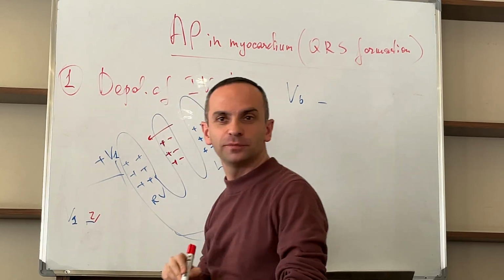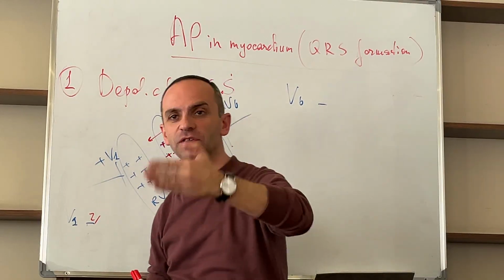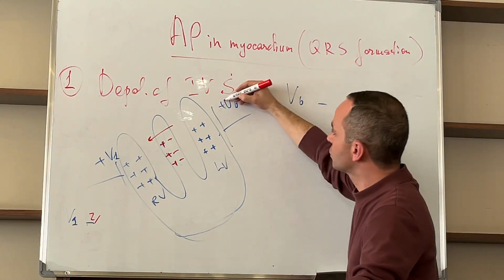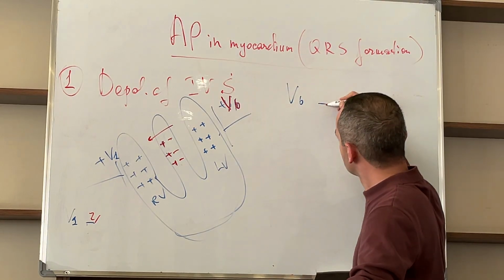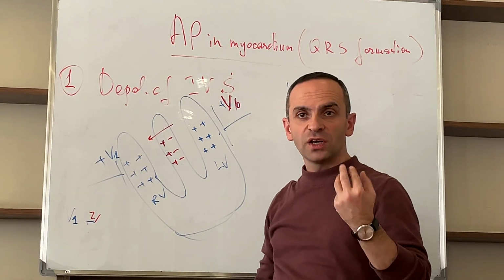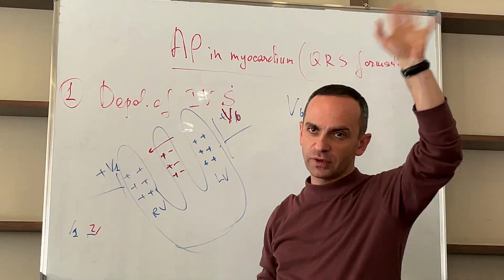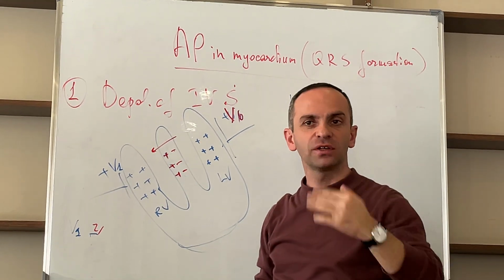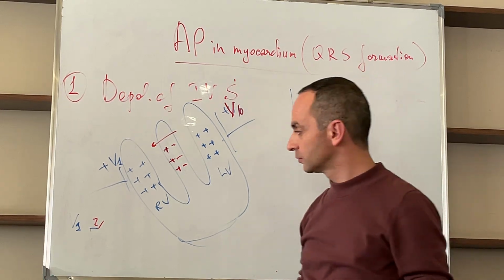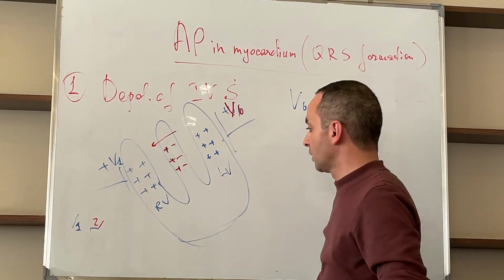It's a small r. Why small? Because the interventricular septum thickness, accordingly its electrical activity, is less than the ventricles. And the same vector has the opposite direction towards V6. Negative, downside. Q. In QRS formation, the first wave, which is negative, is called Q. And any wave which is positive in QRS is R. Was it clear?